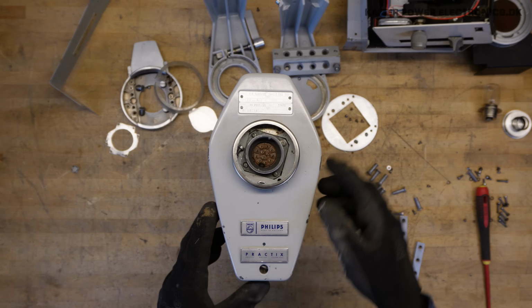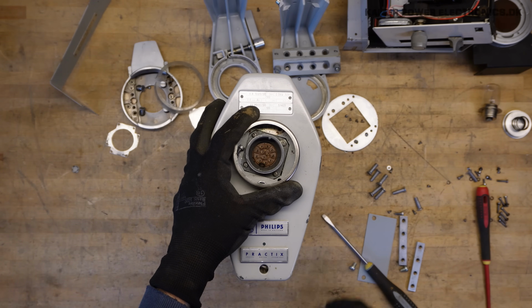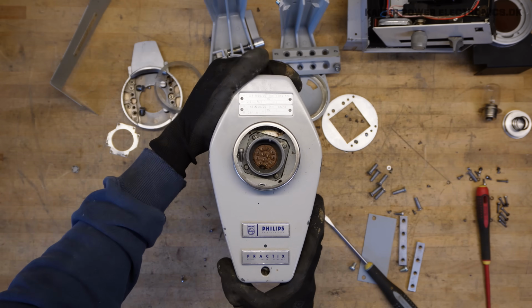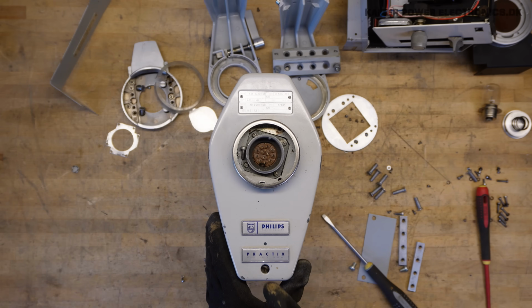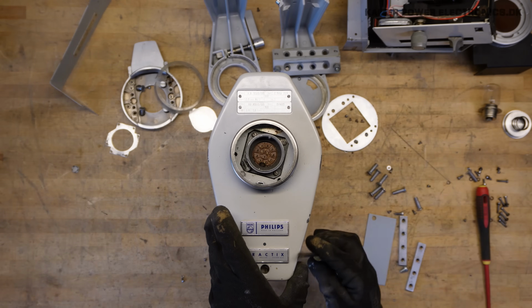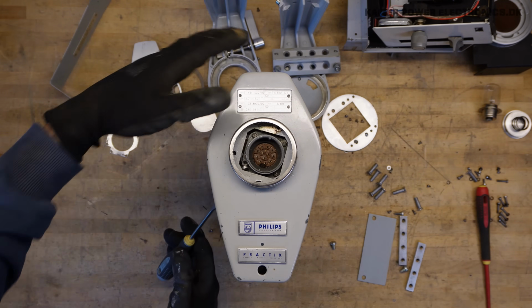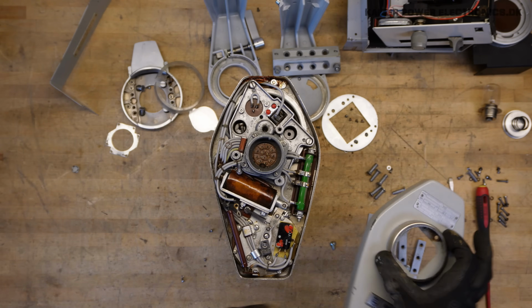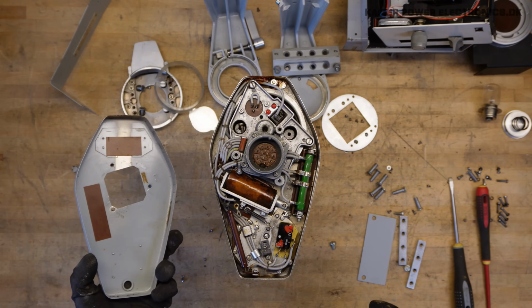There were 3 screws sitting on the inside, on one end of the head here, and maybe I could see some wires. I expected another screw down here, but it's just wires I can see. Okay, that's quite a lot more technique inside than expected.